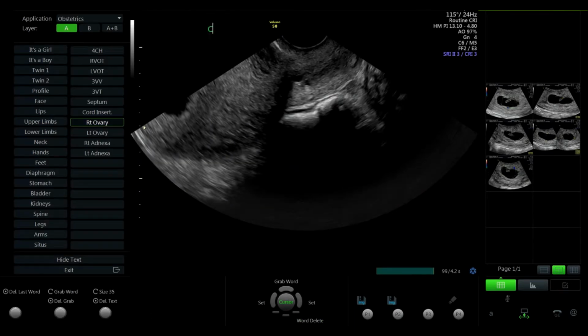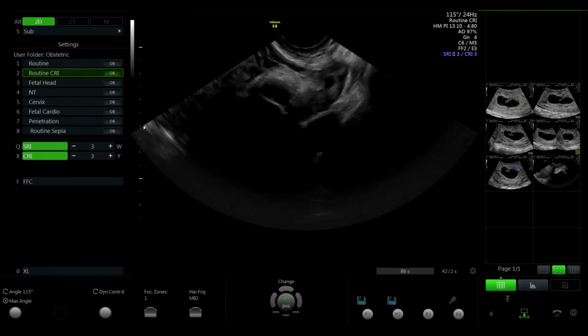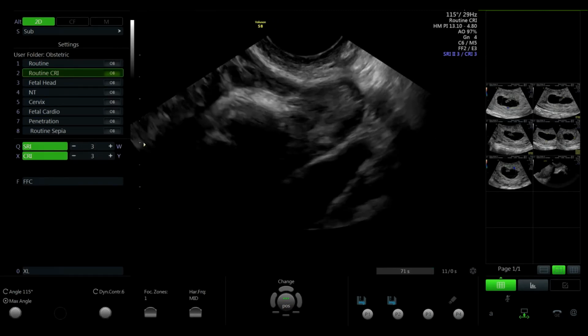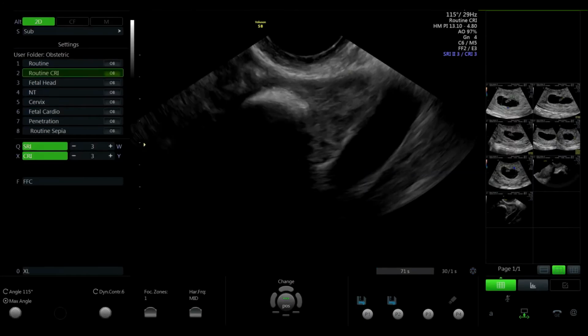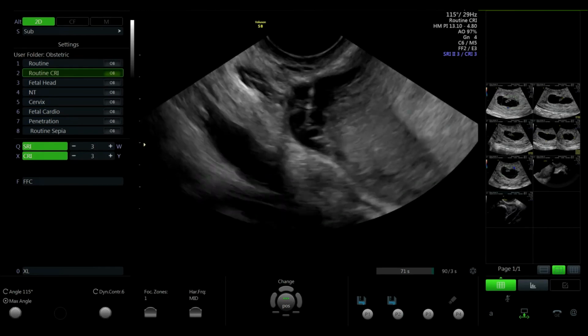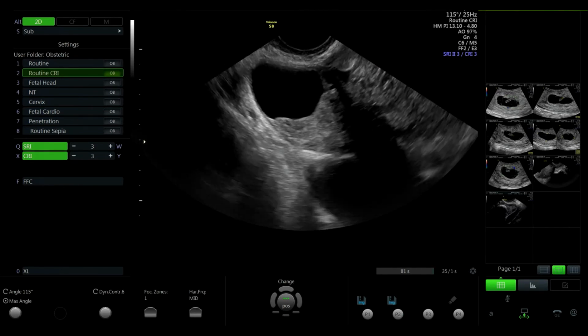The first is they are too early, although it must be remembered that women at the clinic should be 6 weeks pregnant with a positive test 2 weeks before this scan. The other possibility is that there is a problem with the developing pregnancy. They should then explain she will need another scan in 2 weeks in order to be conclusive.